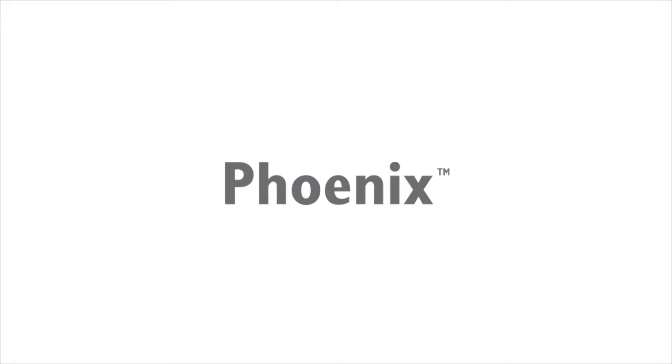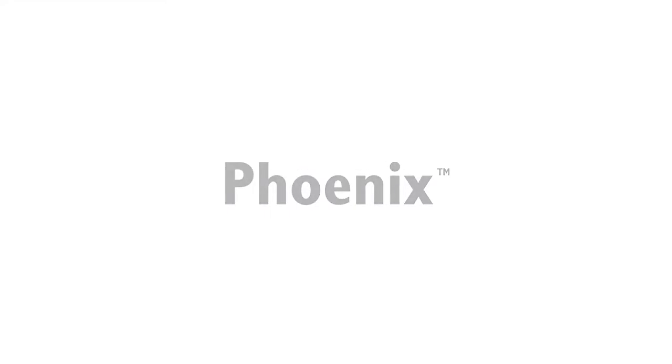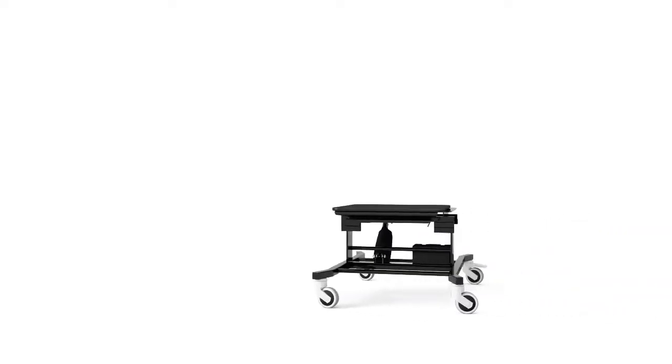The Seating Matters Phoenix has been researched extensively, clinically trialed and built to change the world of healthcare seating.